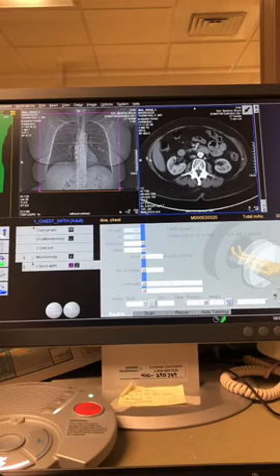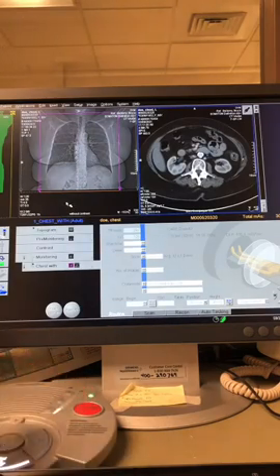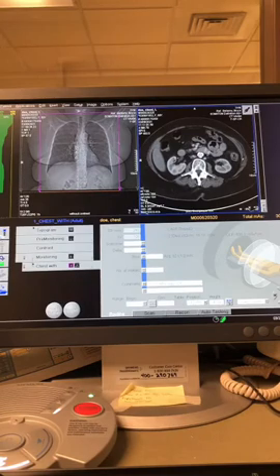One little hack on a Siemens scanner, if you're not sure where to stop, is to open the field before, and then there's a little button on the control panel, way up here, this little thing here. You can abort the scan once you see your destination over here on the right where my cursor is. Anyway, so I set up my box.